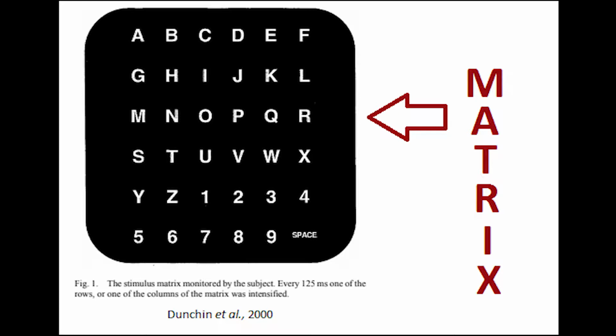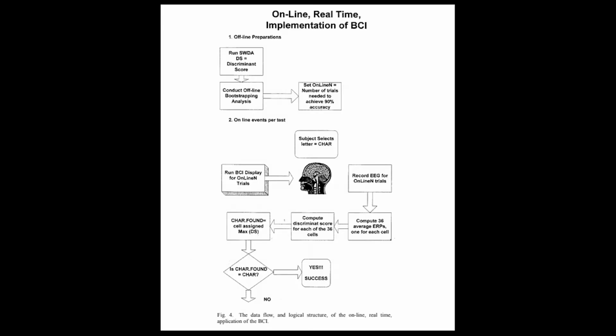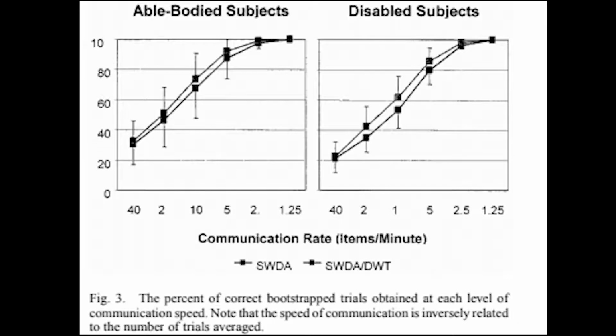intensified. The result of this study found that it is possible to construct a brain-computer interface that, using P300, allows an individual to operate a virtual keyboard without using or requiring any movement of the body, as in the skeletal muscles. This study has contributed greatly to the knowledge of brain processing, as it identifies that EEG and P300 accurately identify the different components of the brain and emphasises the concept of relevance.